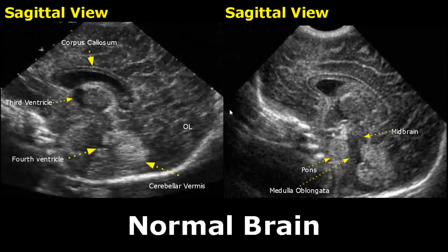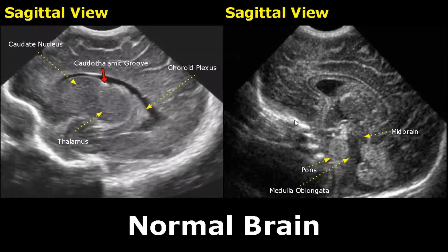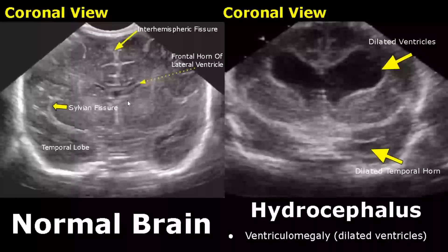This is the occipital lobe. This region is the caudate nucleus and this groove is the caudothalamic groove. Behind the caudate nucleus is the thalamus. This hyperechoic structure is the choroid plexus, which produces cerebrospinal fluid.